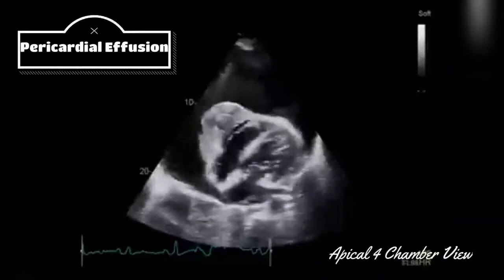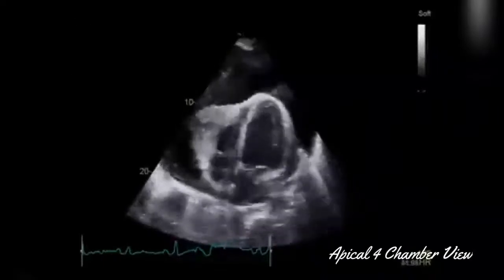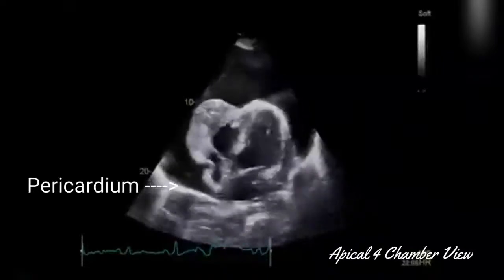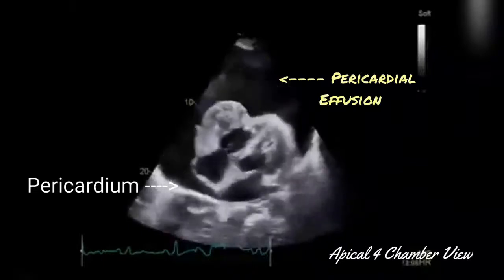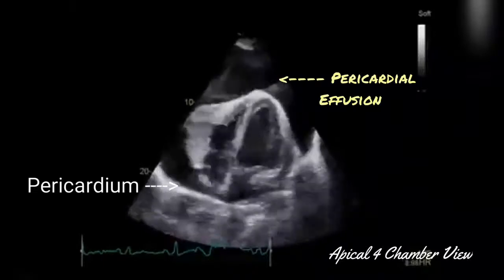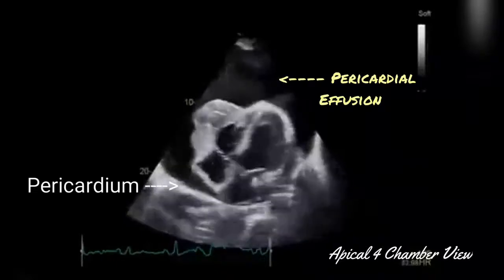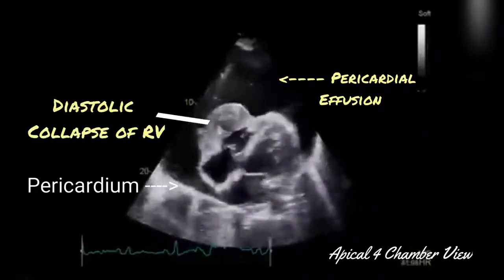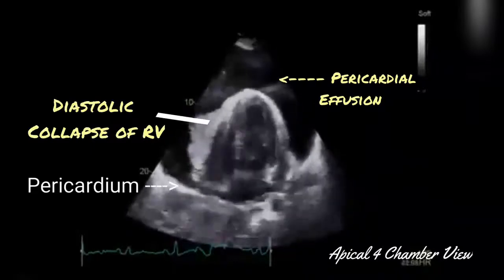This is another clip for pericardial effusion. And we are in an apical 4-chamber view. First of all, we have to recognize the bright hyperechoic line, that is the pericardium. And you can see there is a huge amount of anechoic area totally surrounding the heart, that is a severe amount of pericardial effusion. In addition to that, during the diastole period, you can appreciate there is a diastolic collapse of the right ventricle.